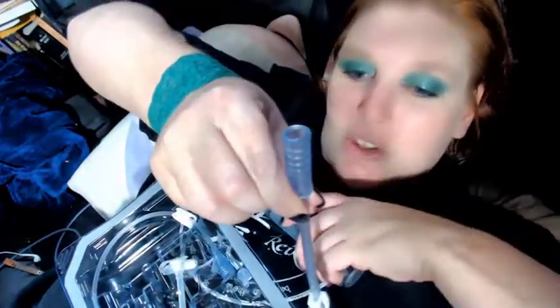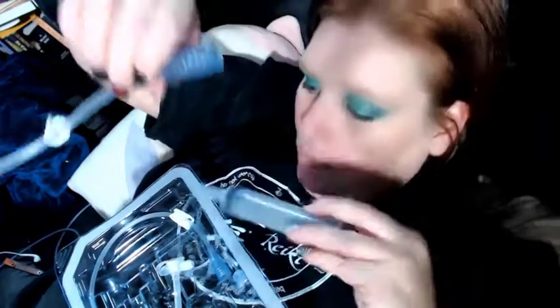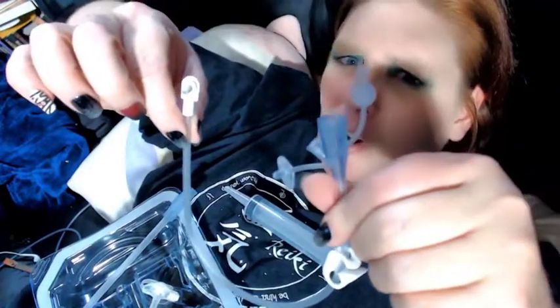This is the part that hooks onto the feeding tube, and the syringe goes in the top, and the formula goes in. And this part I've never really had to use, but there's a way to hook it in, and I guess it's more for if you need to administer medicine or something, but I don't use this part. Or this might be for small children. Like I said, I don't really know because I don't use that part.